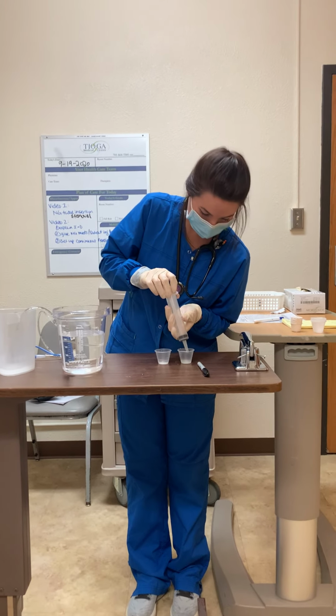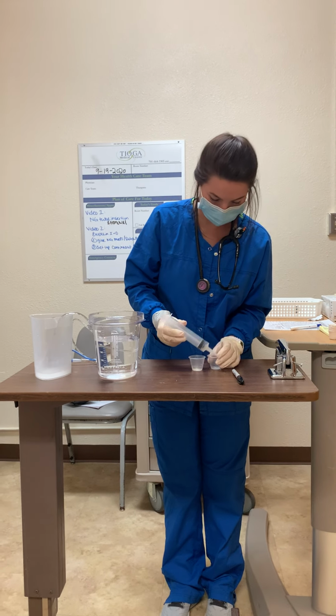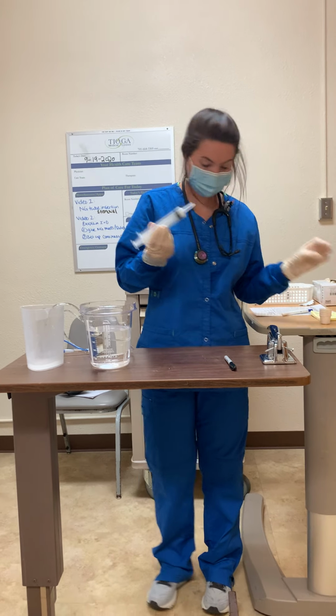We'll do our last medication here. Making sure we have all the liquid.